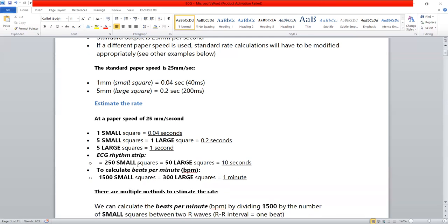There is usually a rhythm strip at the bottom of the ECG, which is usually lead number 2. The rhythm strip contains 250 small squares or 50 large squares. So in one second we have 5 large squares, and in 10 seconds we have 50 large squares or 250 small squares.